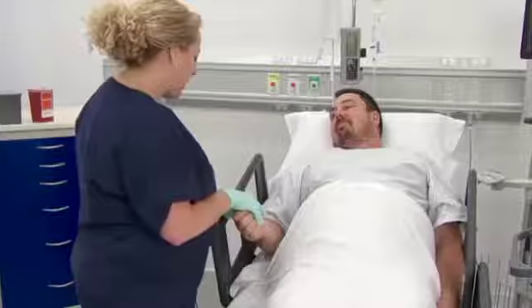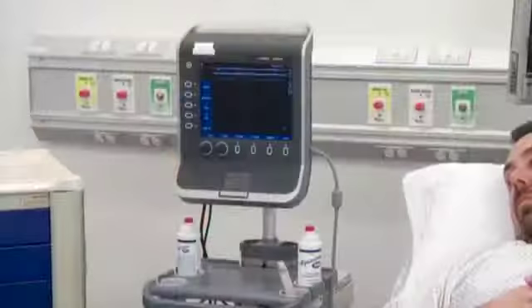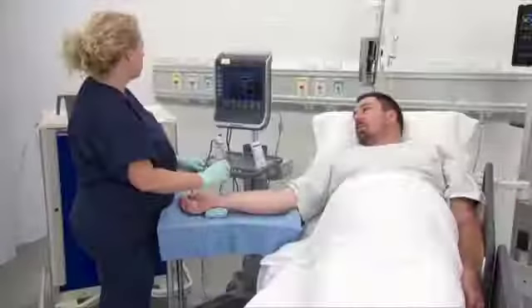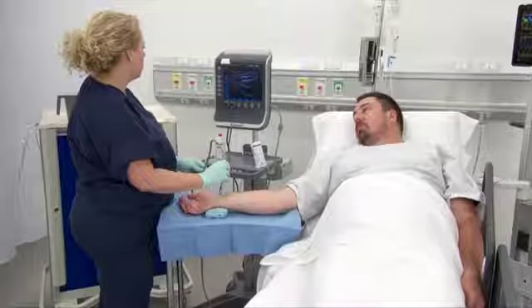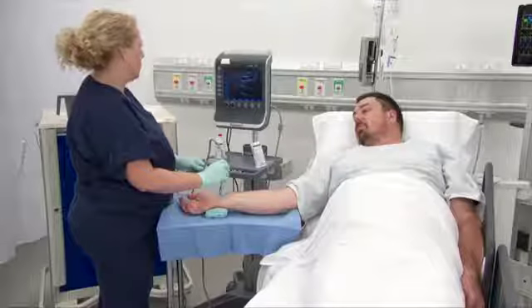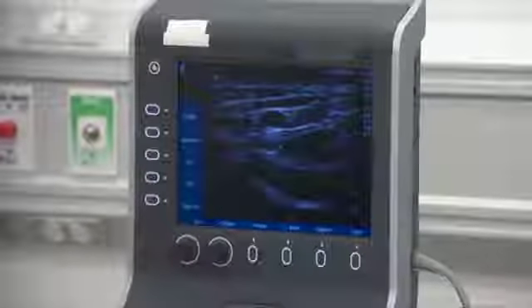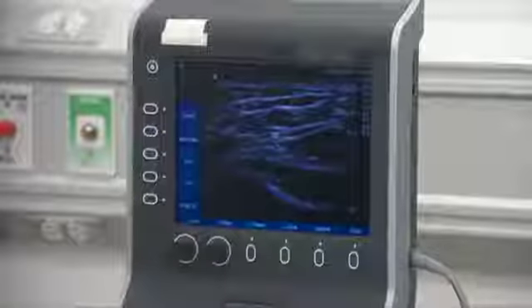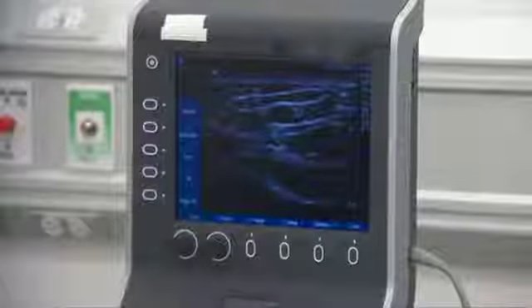Prior to insertion, adjust the bed to the proper height and ensure that the ultrasound machine is in the proper position and easily accessible. Perform a vessel assessment using ultrasound. Using the probe, assess the intended insertion location for the optimal insertion site. Assessment should include the vascular anatomy, vessel depth, and nerve pathways that may inhibit a successful insertion. Avoid choosing a site that would interfere with the range of motion post-insertion.